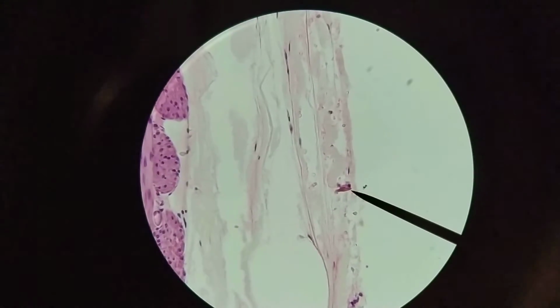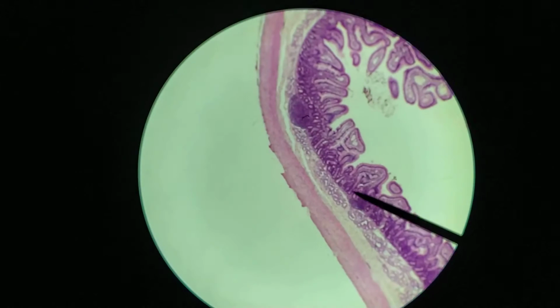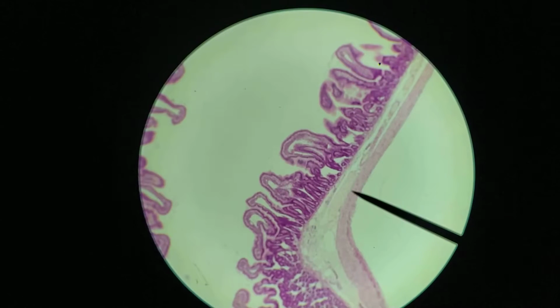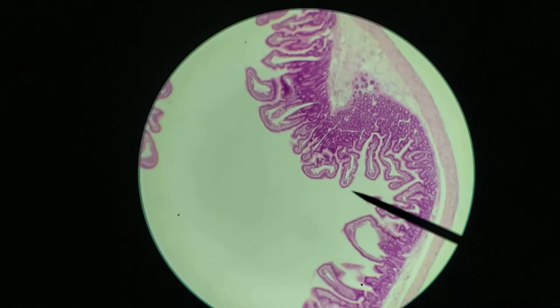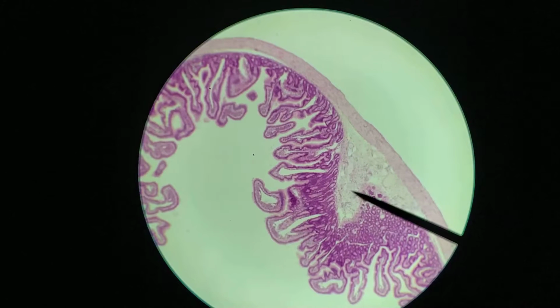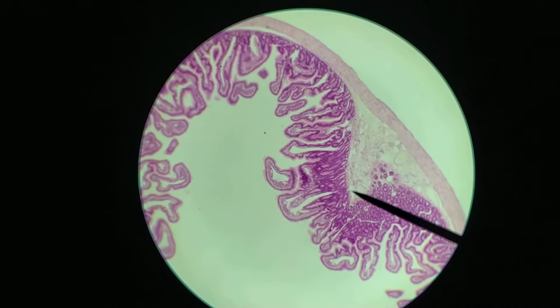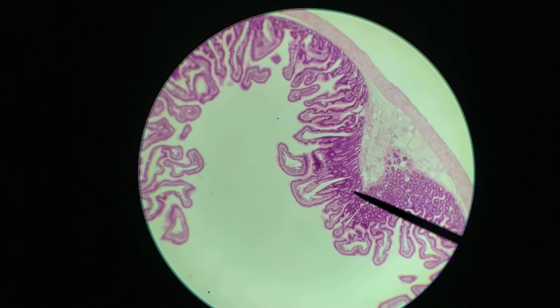Okay, so let's zoom back out and look at the other parts of the small intestine. Here we have another part. Now this one here is the jejunum. Again, we have one of these valves of Kerckring over here. Okay, so this mucosal and submucosal fold.